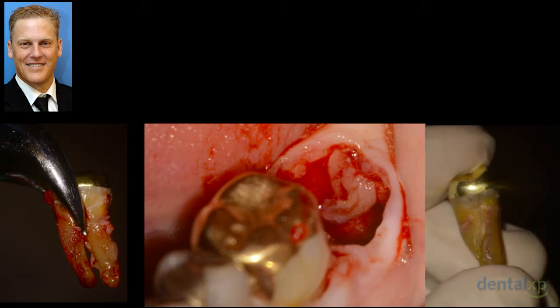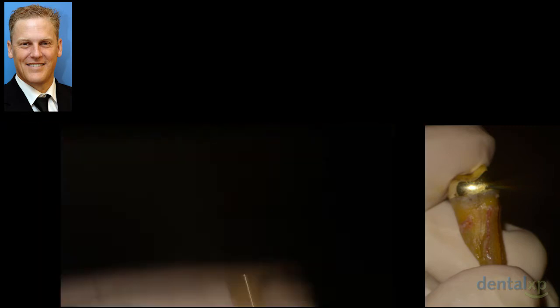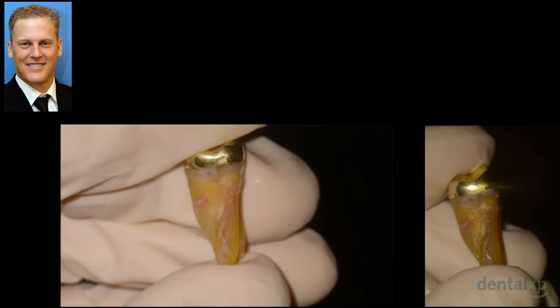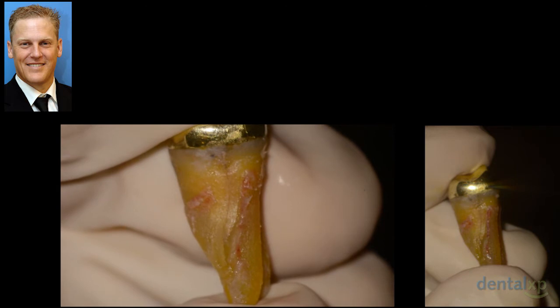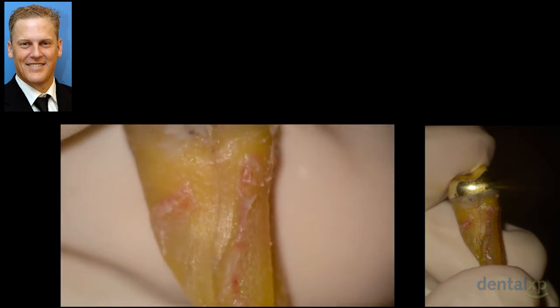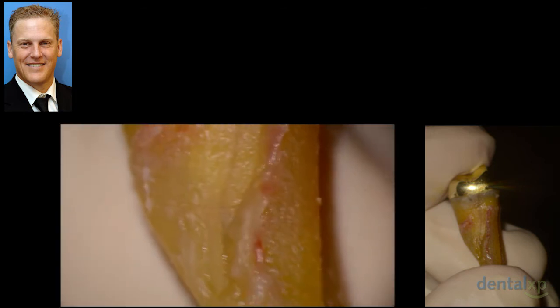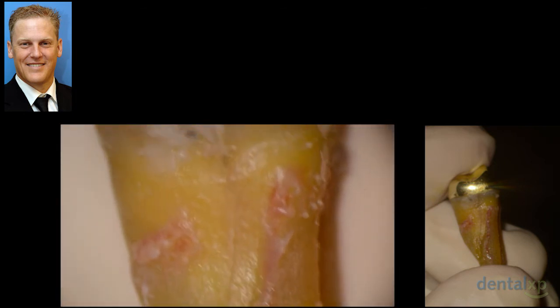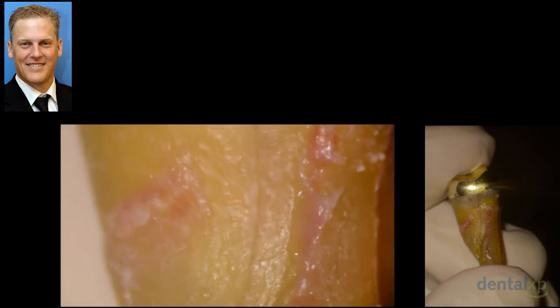When we look at the cause of the loss of this tooth, you can see at low magnification a gold crown. And as we look at the operating microscope, where Nazari and Maxime are going to spend some time showing you the miracles of magnification, you can see as we progress through 5 times magnification the clarity of the crack, the vertical fracture. 8 times mag, 13 times mag, and finally 19 times mag with the tremendous view that's offered to you by the operating microscope.